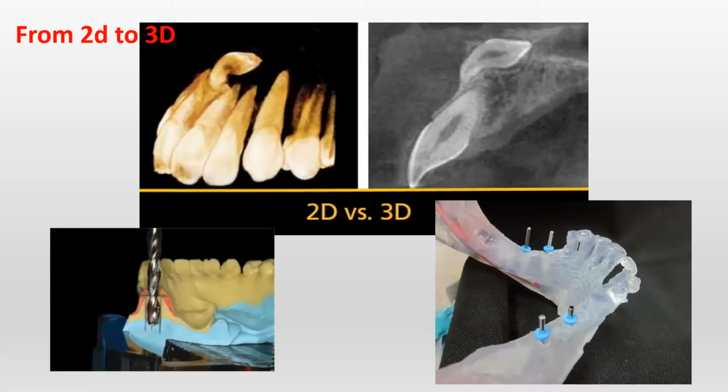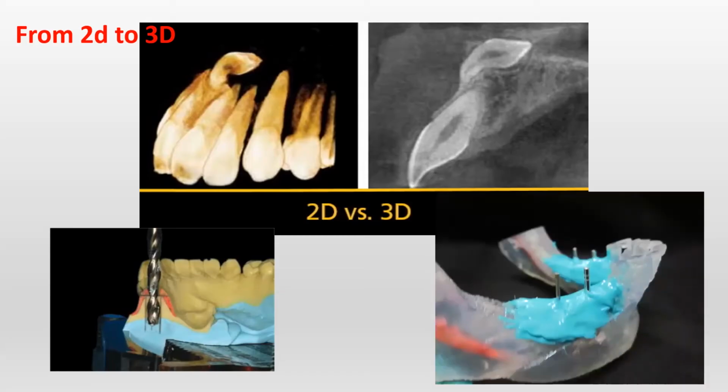There was also a color indicator for the nerves, which would emerge from the mental foramen. Further, the soft tissues were mimicked here, again arbitrarily, using light body elastomeric material. Of course, the measuring of soft tissue thickness would be done on the CBCT sections only. We could see a faint line there and measure the soft tissue. This is an approximate assessment, I would say.